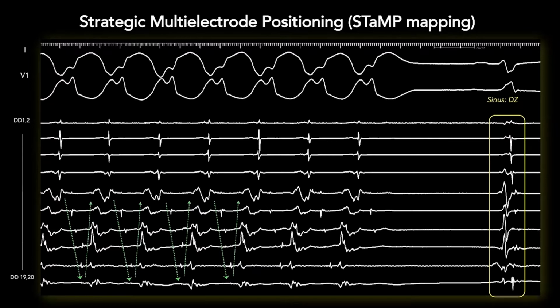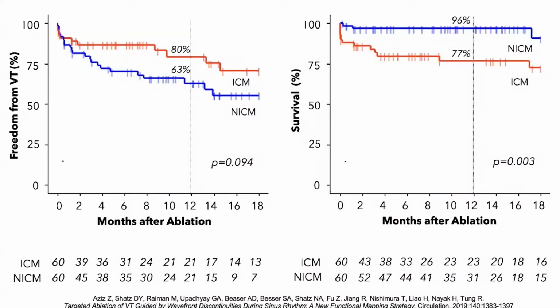Not only do you see diastole moving through these electrodes and back up with this very rapid VT, you're able to appreciate something quite beautiful in the sense that you can map why and where non-sustained VT fails to propagate. Here you can see you have block within the isthmus between these two electrodes. So again, quite beautiful when you can anticipate based on the isochronal activation map. And this is why we're able to map any VT circuit, even with one beat. This is one-beat contact mapping.